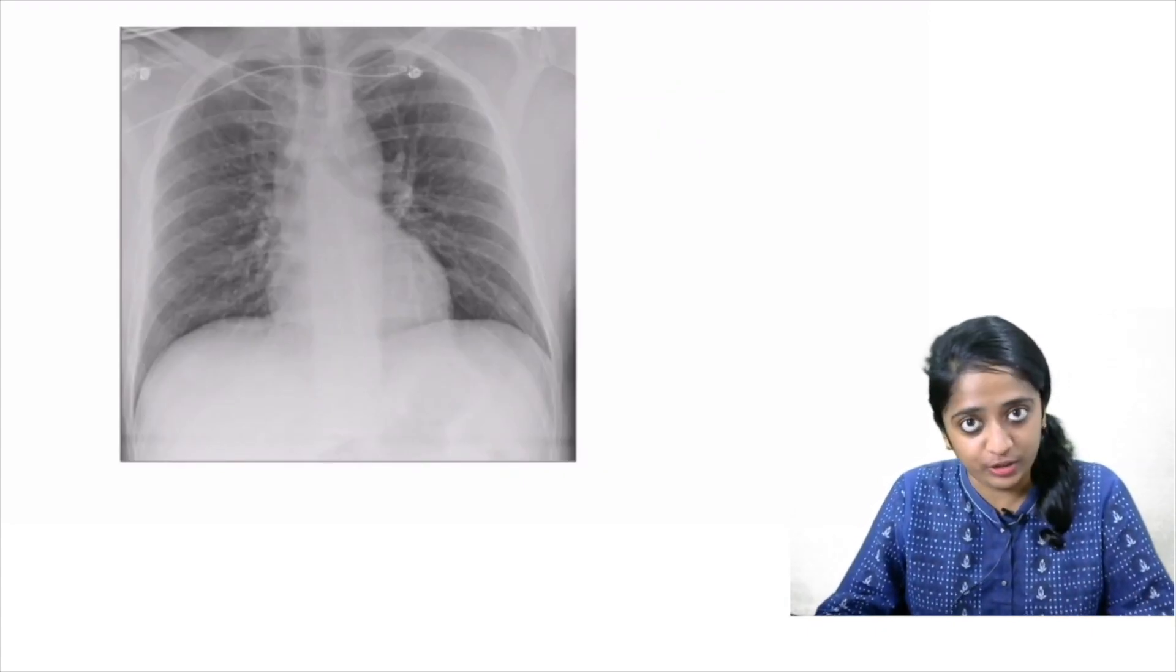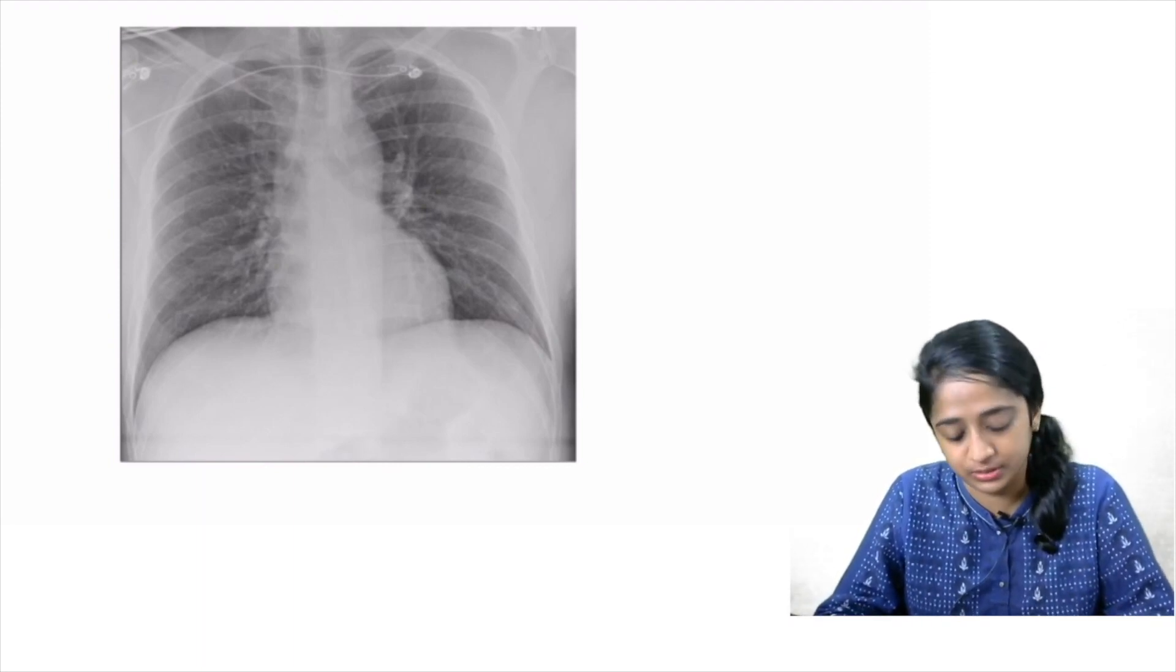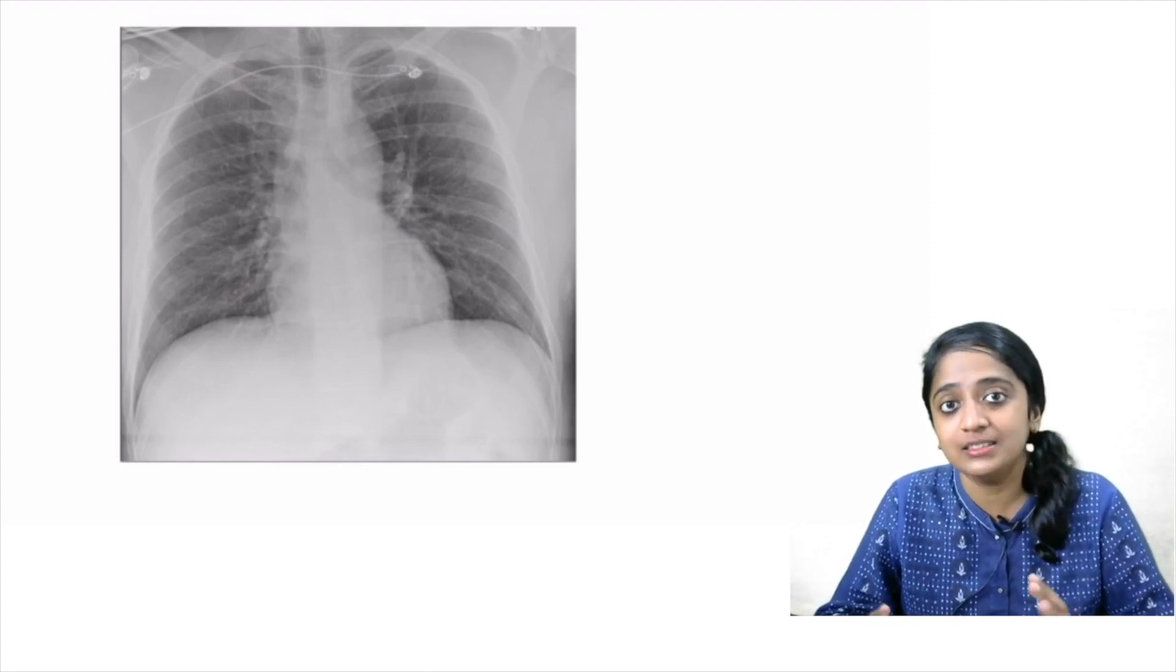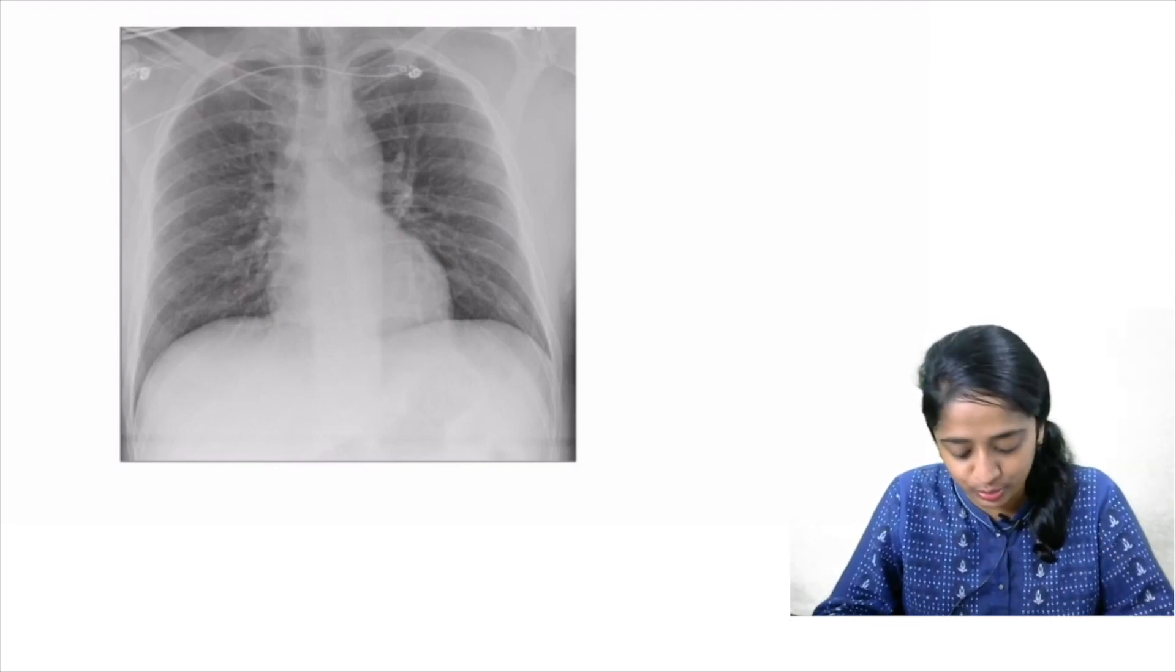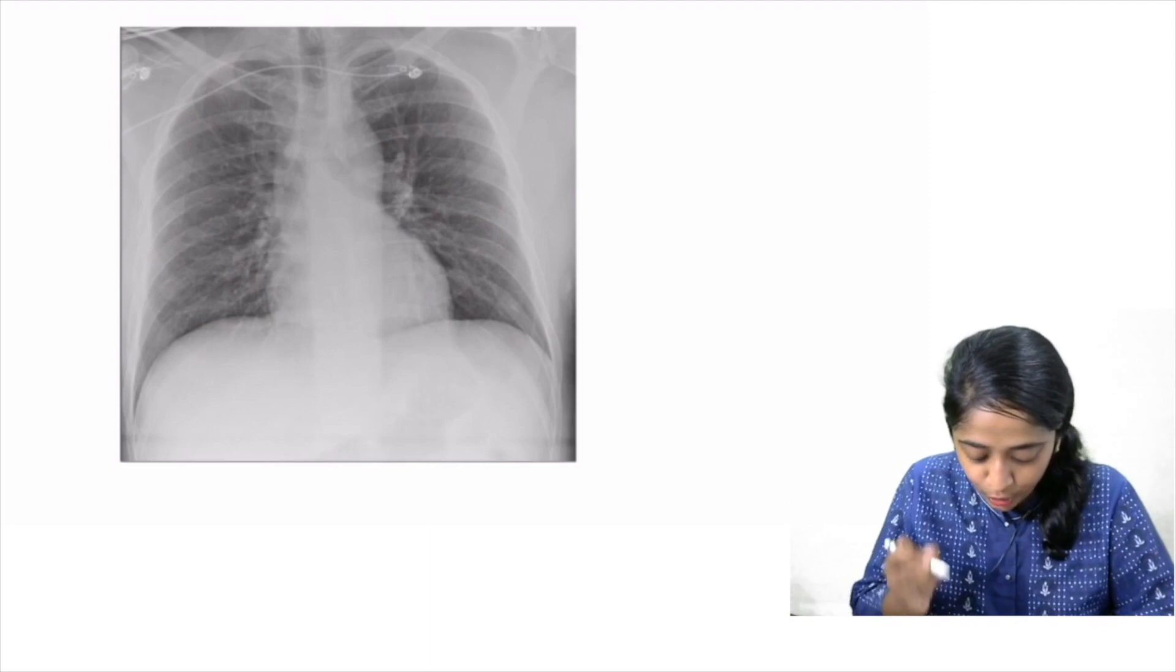Given to you is a radiograph. You can pause for a moment and look at the radiograph clearly to find out the diagnosis. Still you have not managed to see that. If you feel that it is apparently normal, what can you do? You have to compare both lung fields for symmetry. So comparing the right and the left lung field, what do I feel?